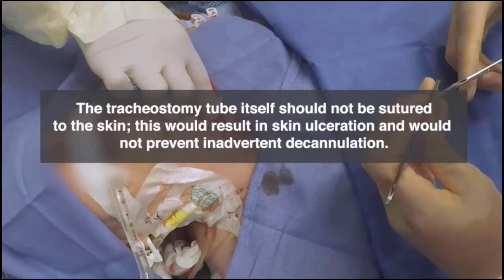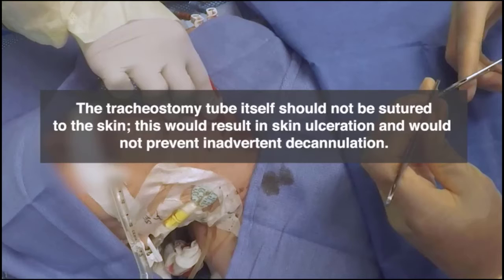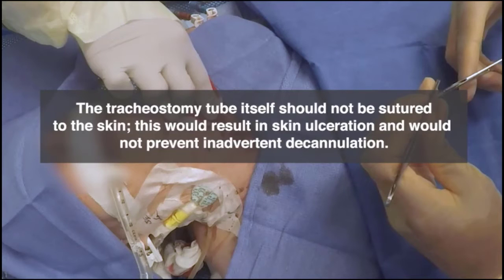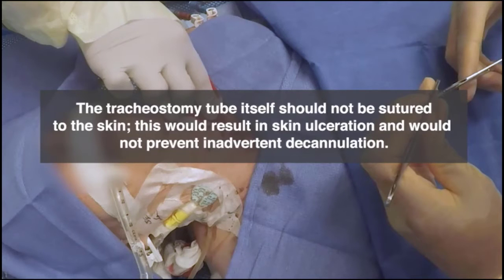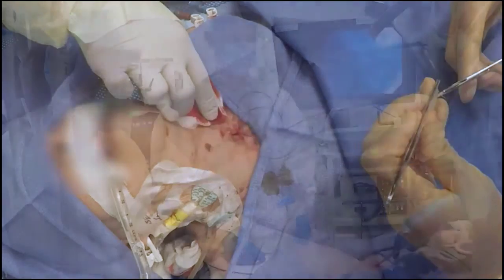The tracheostomy tube itself should not be sutured in. Suturing a tracheostomy tube results in skin ulceration and does not prevent inadvertent decannulation.